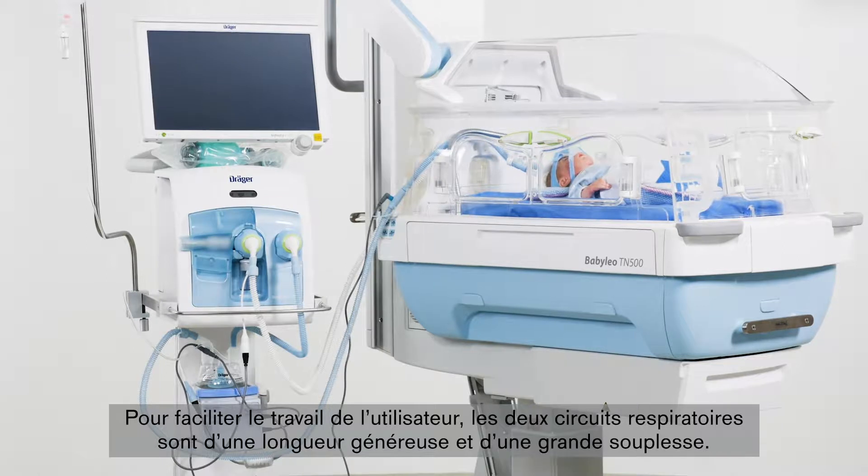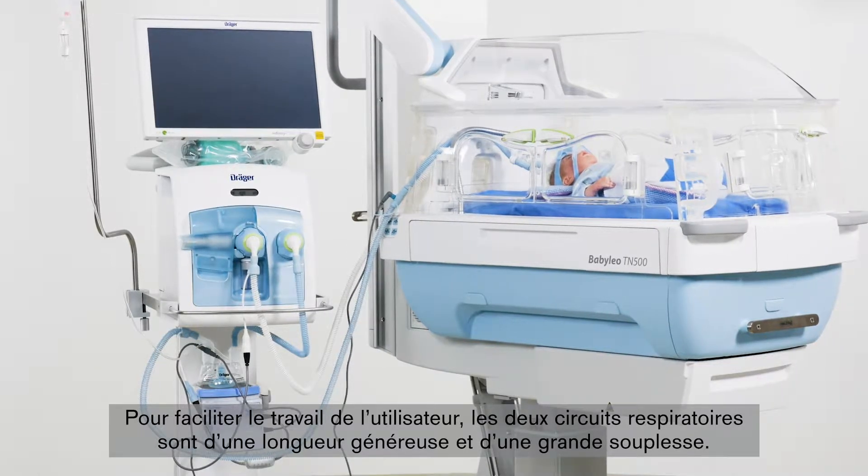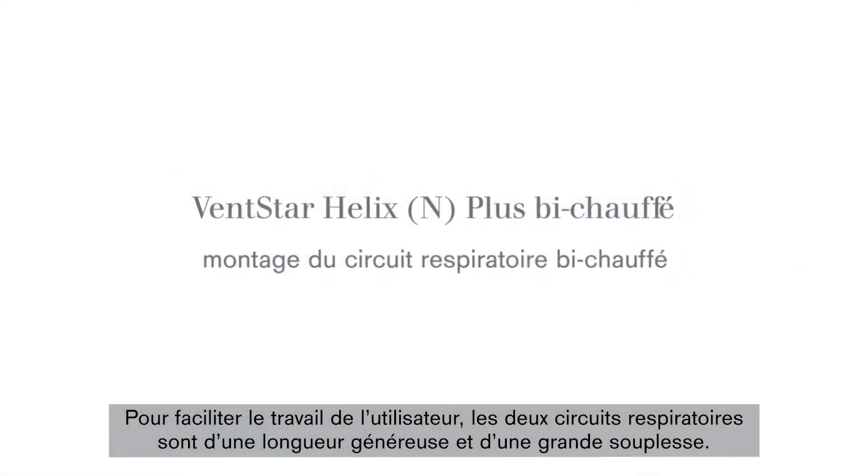The comfortable length of both breathing circuits and the high degree of material flexibility supports easy handling for the user.